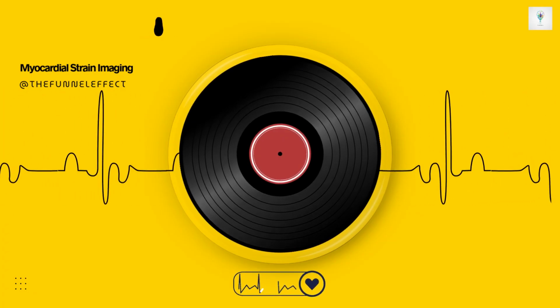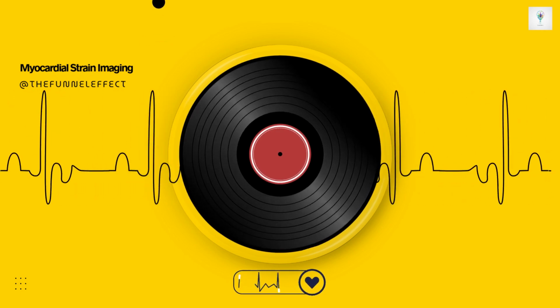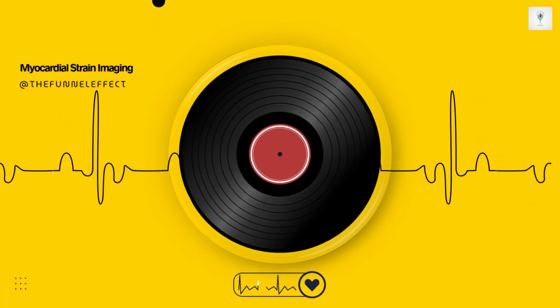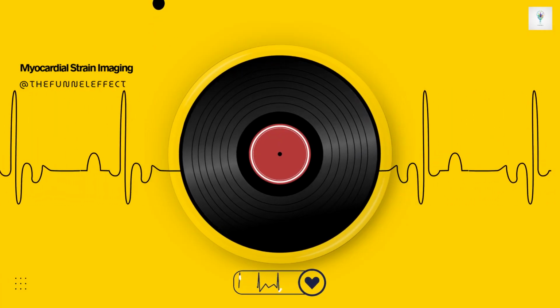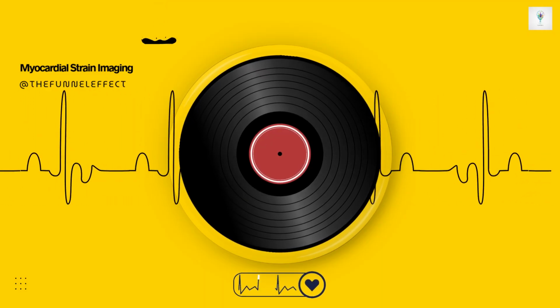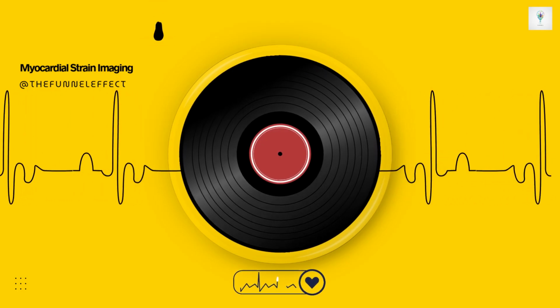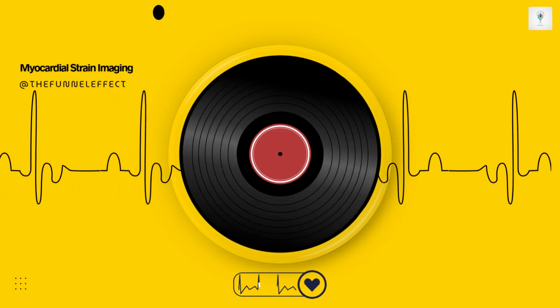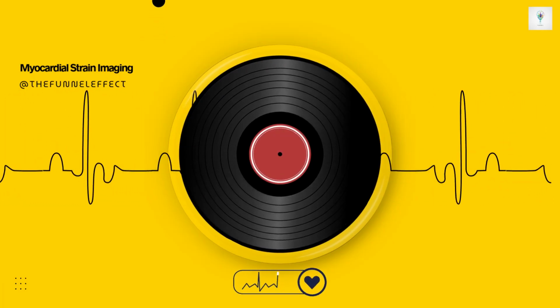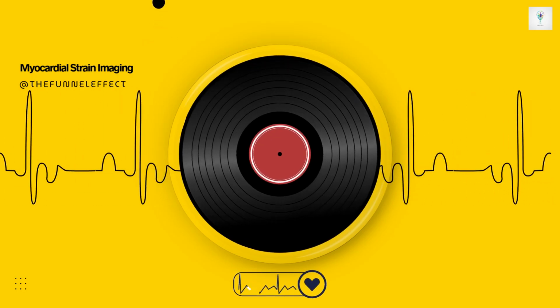This really is the core message of the review and why strain imaging has become so indispensable in modern cardiology. GLS acts like an early warning system. It picks up problems in conditions like heart failure with preserved EF, HFpEF, or early valve disease, or during cancer therapy monitoring situations where the LVEF often looks deceptively normal. And the review breaks down why it's more sensitive into 3 distinct mechanisms. Yes, 3 really powerful, quite distinct reasons why GLS sees damage before EF does.